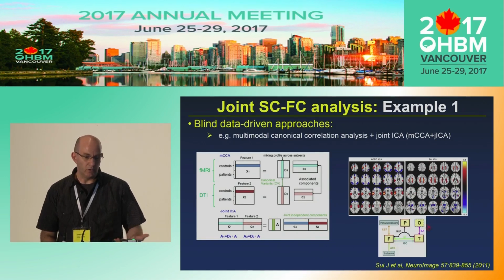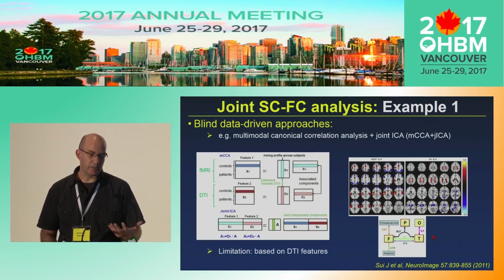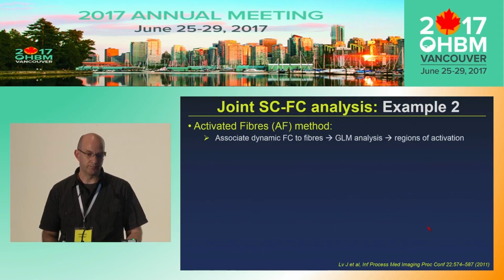And then they can go over to, for example, start creating, based on the regions and the pathways involved, some high-level network pathways to explain these differences with these pathologies. One of the disadvantages of this, compared to the other ones I'm going to show in the rest of the talk, is that it doesn't use whole brain tracking. So in some ways it's a limited amount of information related to structural connectivity, but it's still very useful information you can connect between these two modalities.